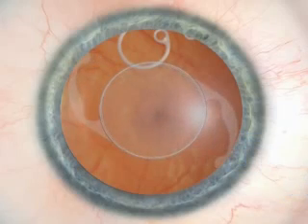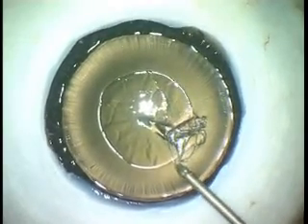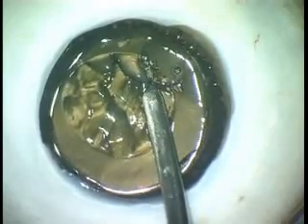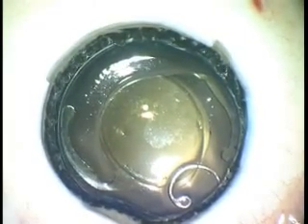The lens is implanted into the bag. This video shows the cadaver eye from the anterior viewpoint. The ring is positioned in place with the help of the injector to support the capsular bag equator. The crystalline lens is removed, and a one-piece acrylic IOL is easily inserted into the bag with the ring in place. The haptic elements are positioned perpendicularly to the fixation element, and the IOL centers well.